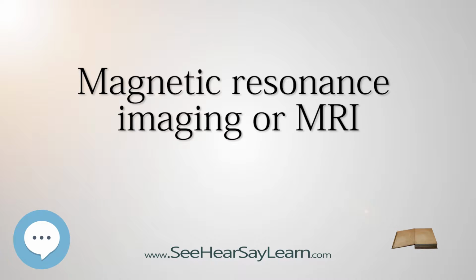There may be risks and discomfort associated with MRI scans. Compared with CT, MRI scans typically take greater time, are louder, and usually require that the subject go into a narrow, confining tube. In addition, people with some medical implants or other non-removable metal inside the body may be unable to undergo an MRI examination safely.